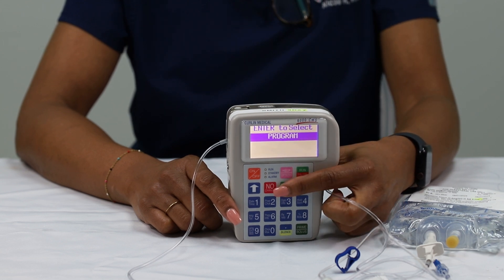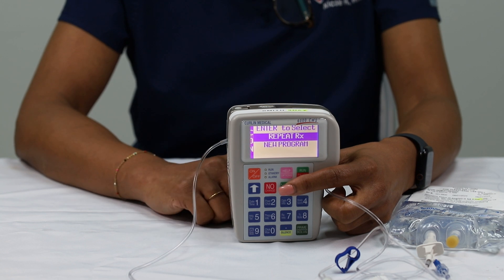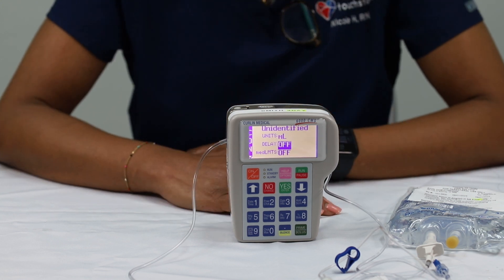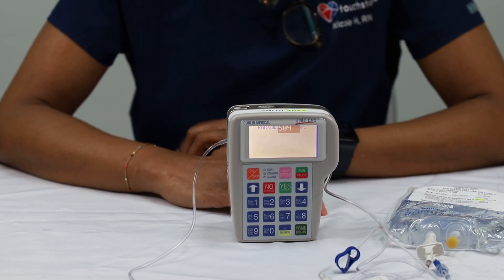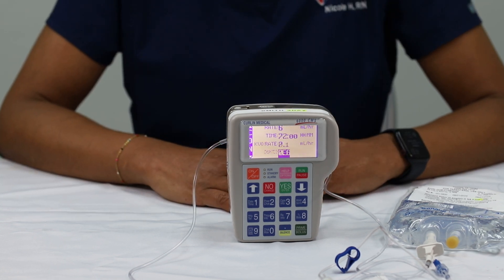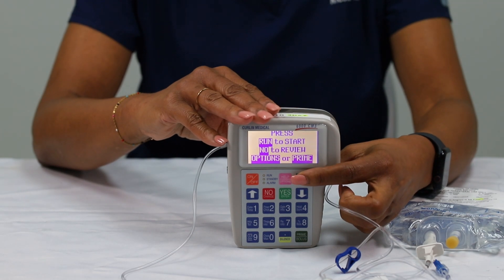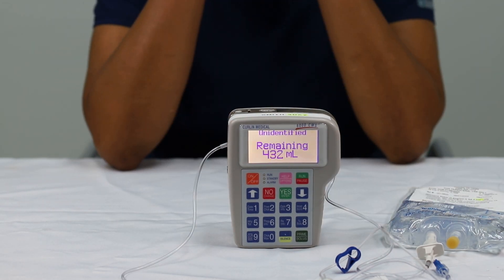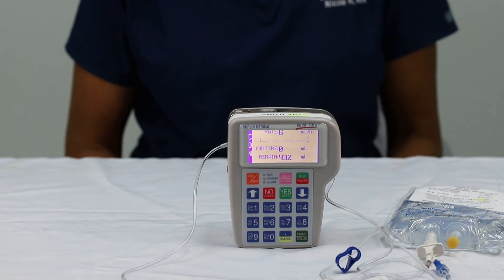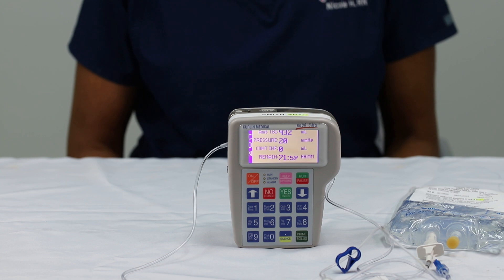Turn the Curlin pump on again by pressing the orange on/off button located at the top right of the keypad. Select program by pressing the green yes/enter button. The pump will display a series of screens highlighting the bag volume, volume to be infused, the rate of medication ordered per hour, and total time of the infusion. Finally, select run by pressing the run/pause button on the upper right of the keypad. The green light next to run will begin to flash. You have now successfully started your infusion using the Curlin pump.